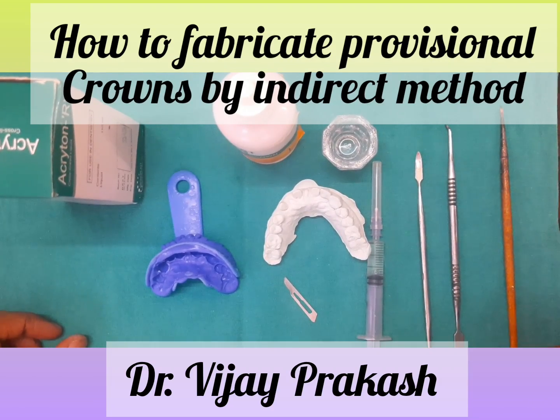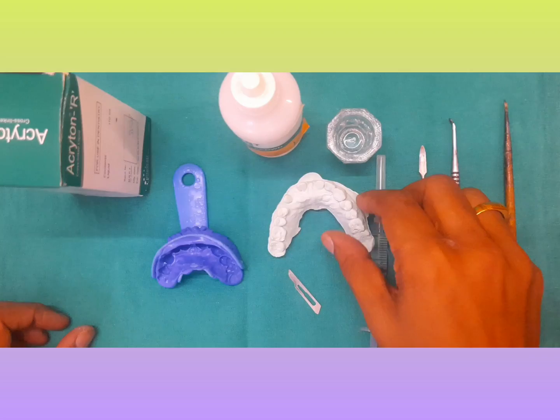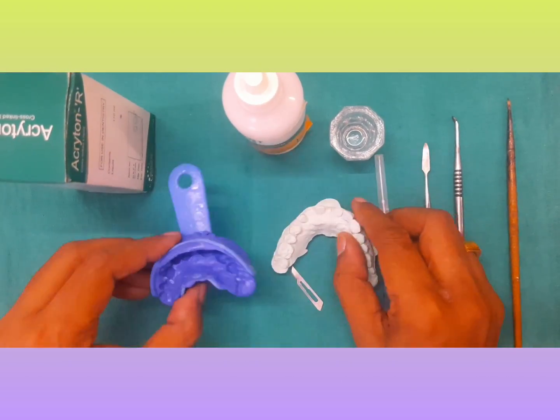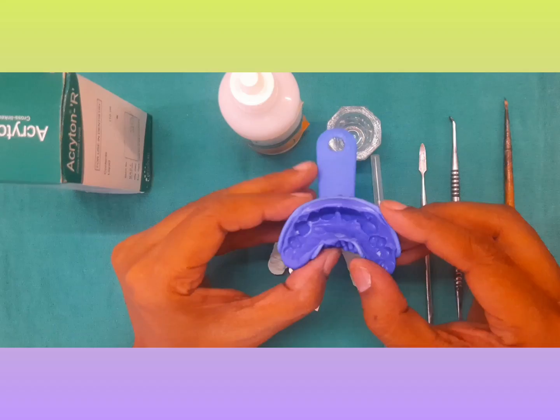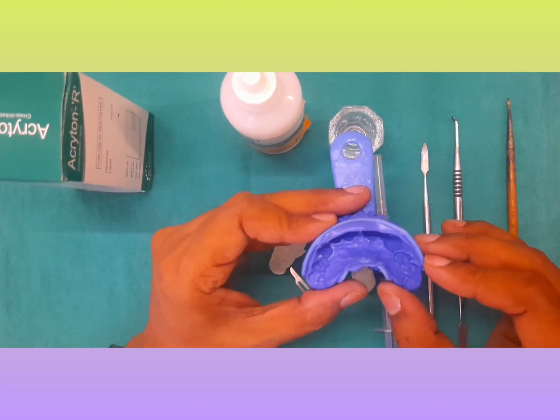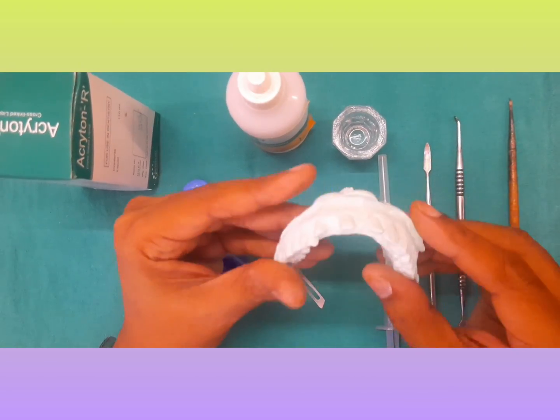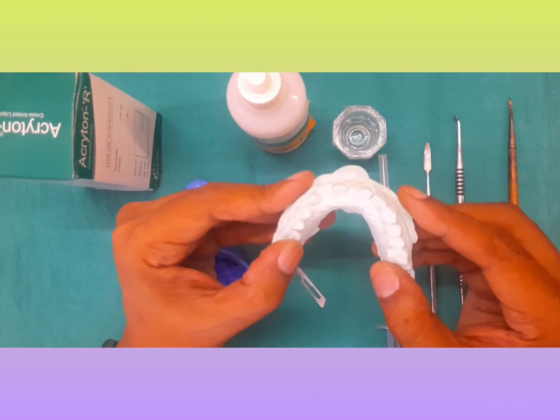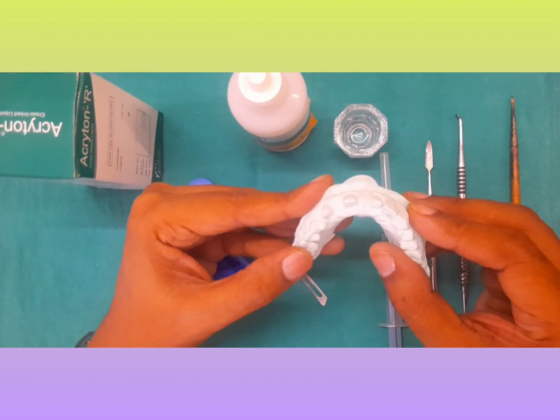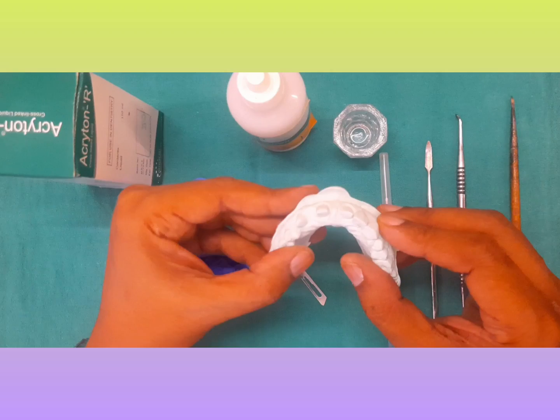Hello friends, I am Dr. Vijay Prakash and today I will be telling you how to make temporary crowns by indirect method. So we have taken an index of the natural teeth, the teeth which were prepared, and then we have done the preparation, made a check cast, and over this check cast I will be fabricating your temporary crowns. I will be showing you how to do that.